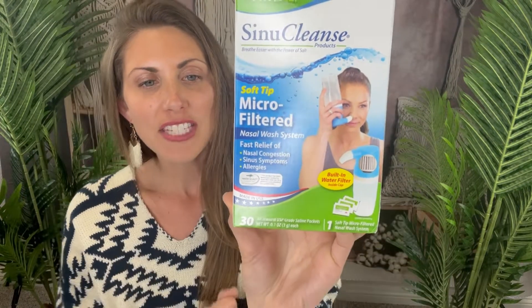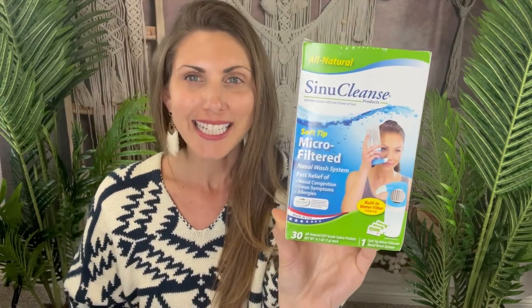This is what it looks like with the girl doing it, and it's got all the safety features in place. It was really easy to clean afterwards — highly recommend. I've tried other things before and this one was the easiest I've ever tried.